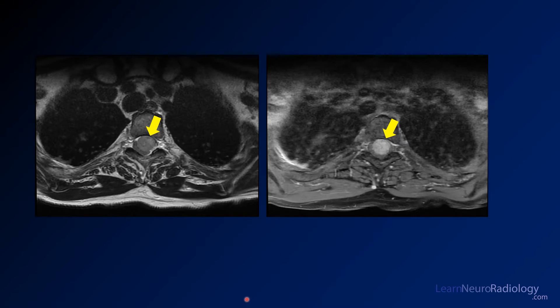On the axial images you see the same thing. There is this mass pushing the thecal sac to the side, and you can see a little bit of epidural fat there.